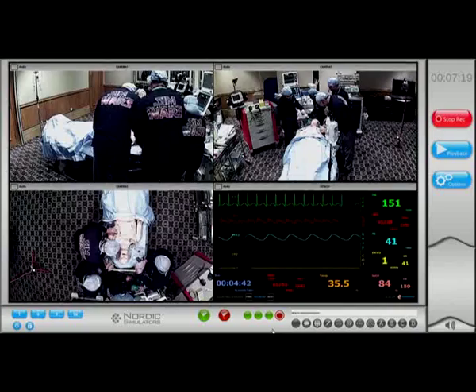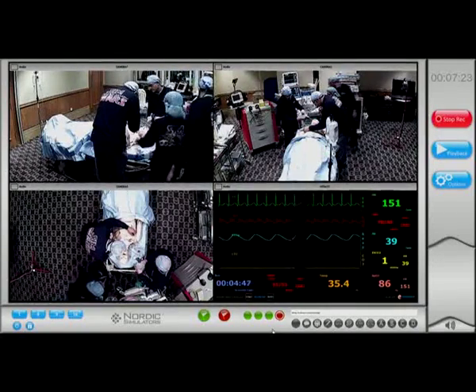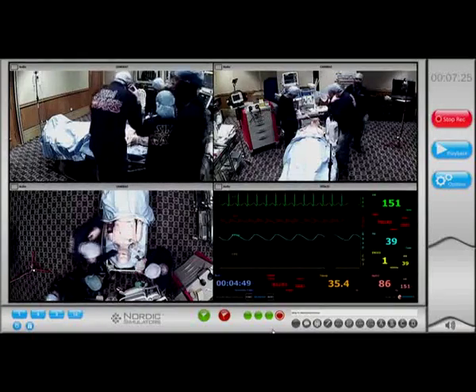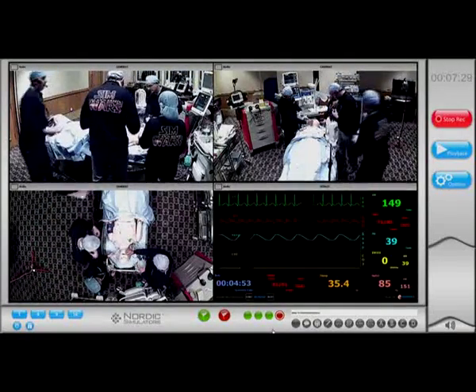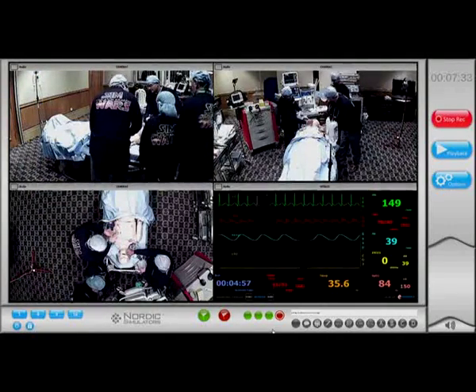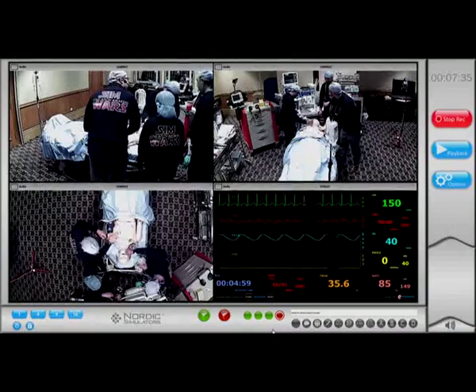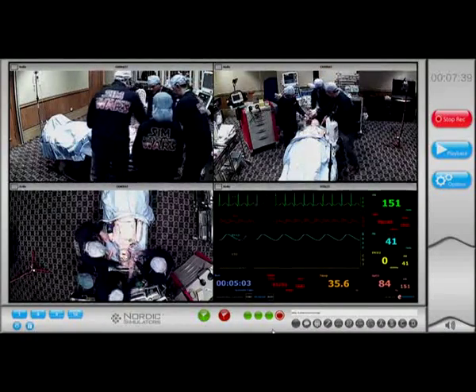The manager on the left side. He's breathing. Okay. Shall we fix it? He's breathing spontaneously. Okay, but support him, please. Support him. And BP now still.